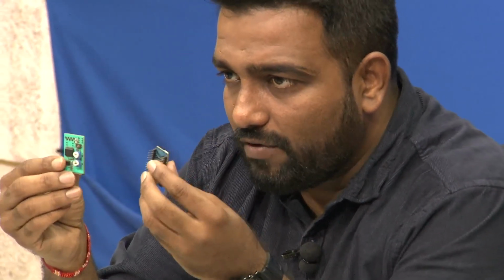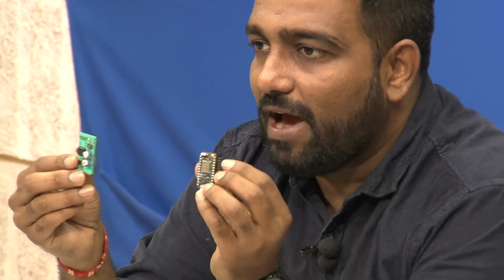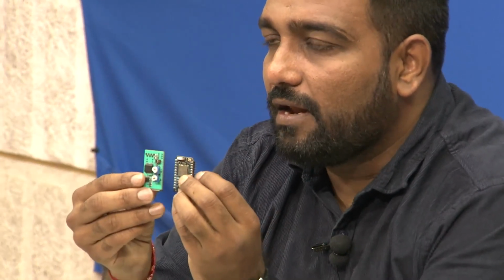However, we can also use other electronic modules for wireless transmission. This is just one way of transmitting. We can also use PSOC as an alternative way, right. But here we are using the electronic module, which is our circuit right over in my hand, and we have to connect with this, so that we can wirelessly transmit the signal from the EEG to the laptop, and then we can further process it.